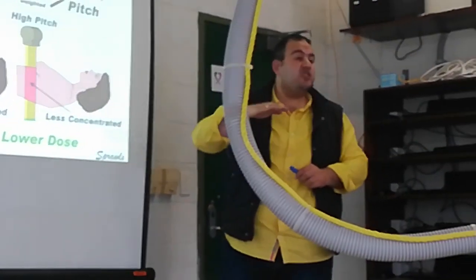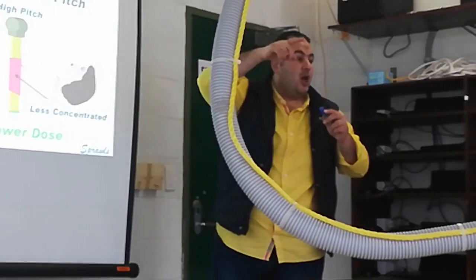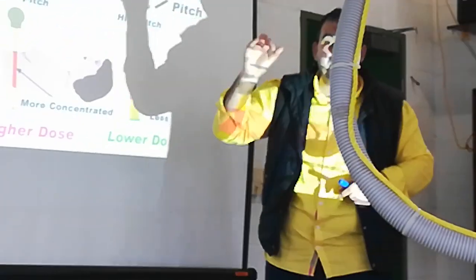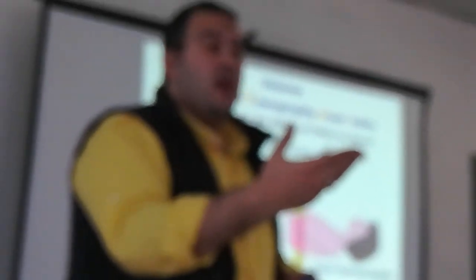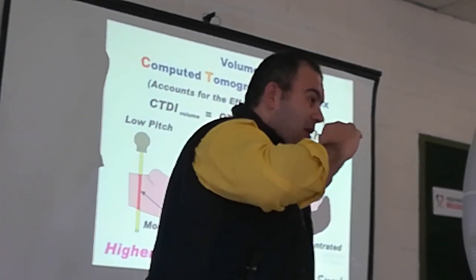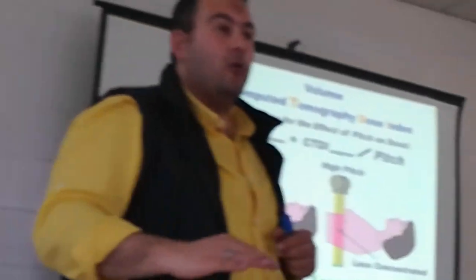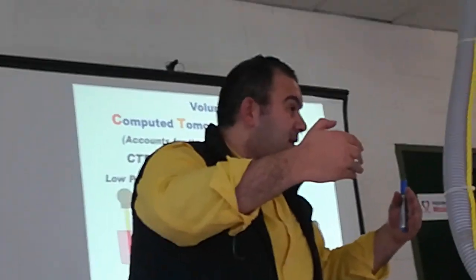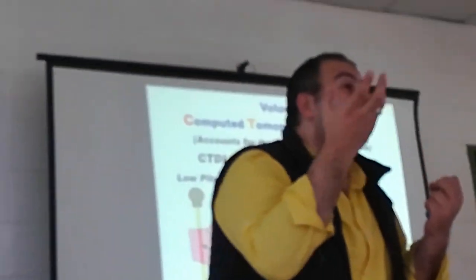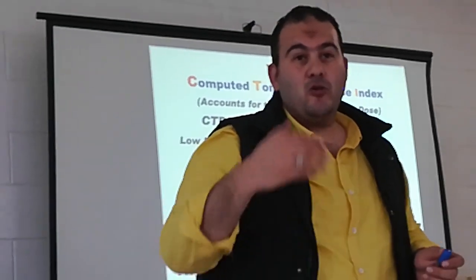What's the meaning of pitch? Pitch is the table distance, table speed per rotation time. If we scan a patient and we adjust the pitch factor to be higher, that means the table speed will be high. If we adjust the pitch factor to be a low value, that means the table speed will be low. When you scan a patient with a high table speed, that means the patient is exposed to a low dose of radiation, because the table is moving so fast.